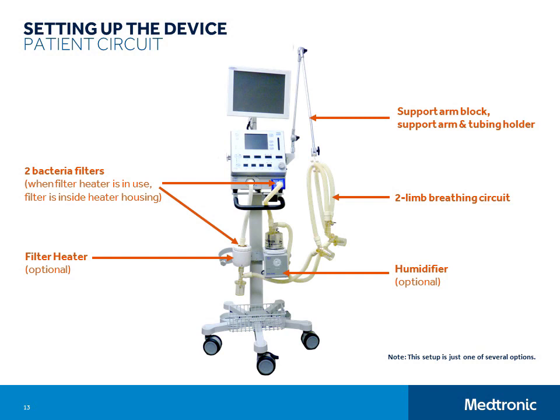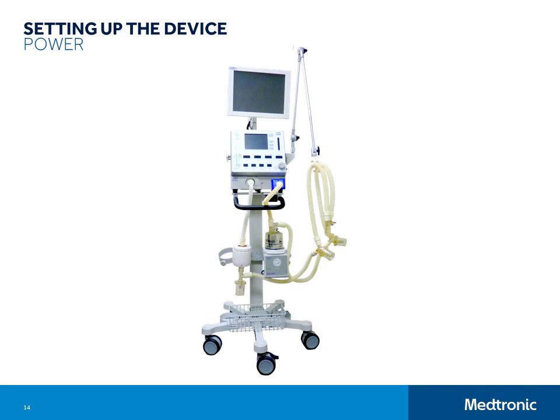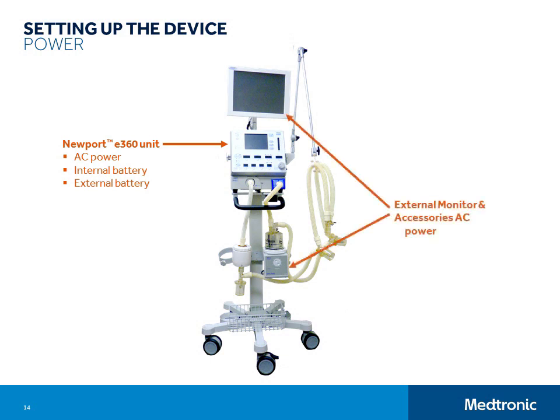Next, we'll connect the E360 and accessories to power. The E360 can run from AC power, internal battery power, or external battery power. The flat panel display, external touch screen, and other accessories run from AC power. Under normal use, you will plug the ventilator and accessories into AC power. AC power charges the E360's internal battery whenever E360 is plugged in and the indicator on the front panel is lit.